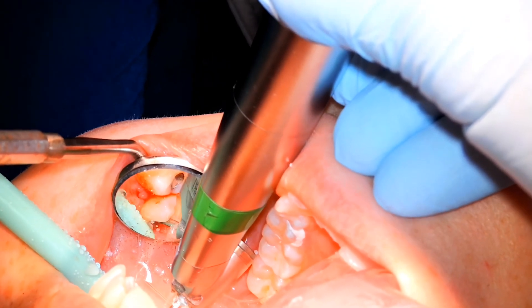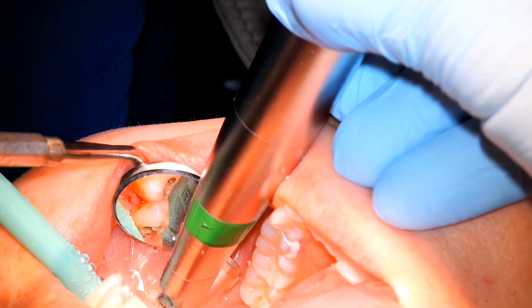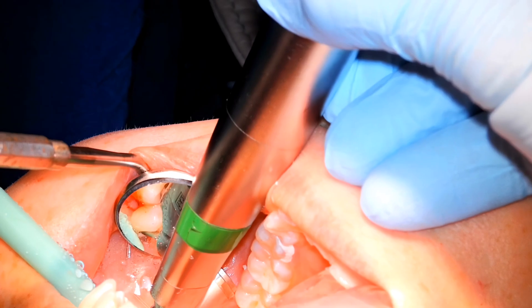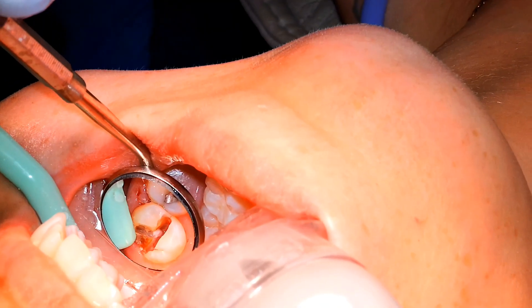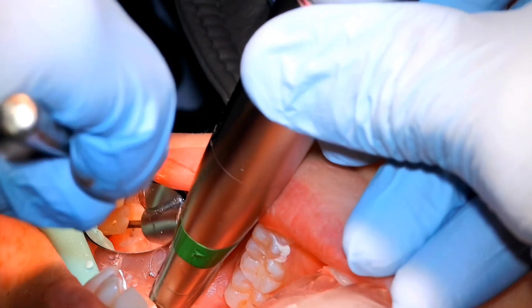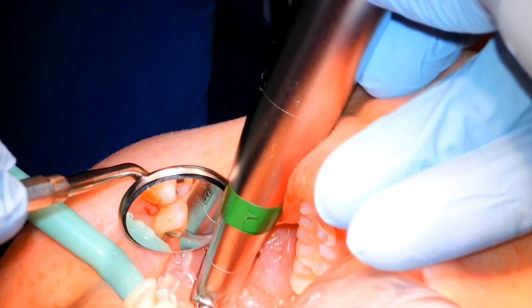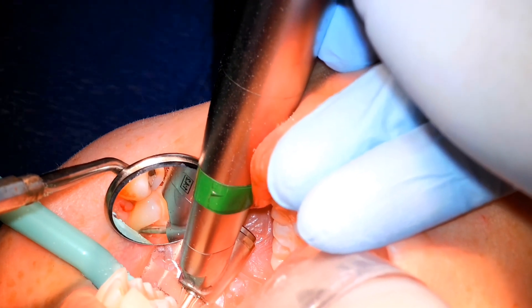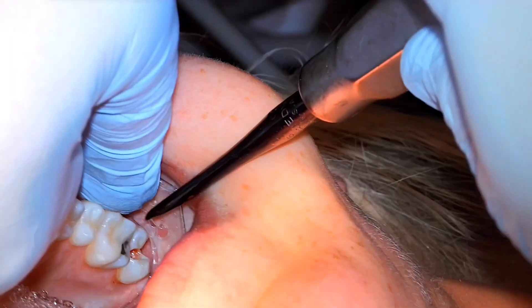You'll see the flutes get gunked up on the bur — they get white — which decreases cutting efficiency. This handpiece uses a water jet rather than air, so it's not putting air into the surgical field. The amount of water on the flutes was probably less than ideal here, though sometimes you get too much and the patient ends up drowning. I am using the Isodry, which is a system that protects the airway — that's what the patient is biting on. It's fantastic; I use it for oral surgery and routine dental work.